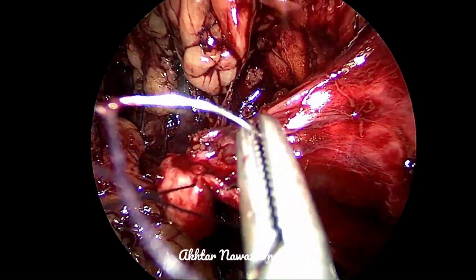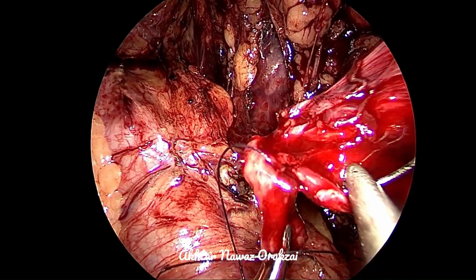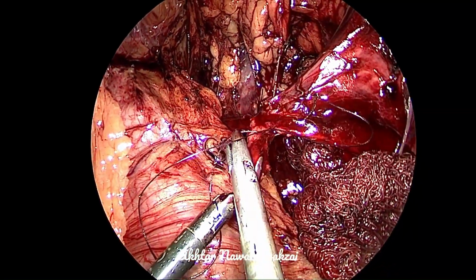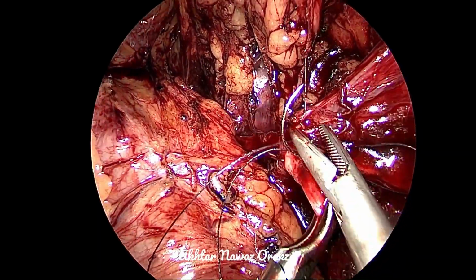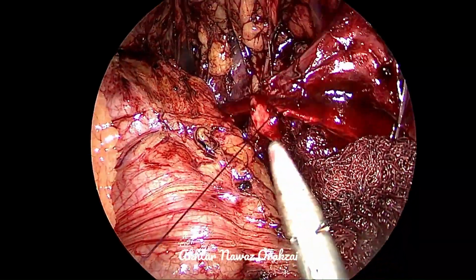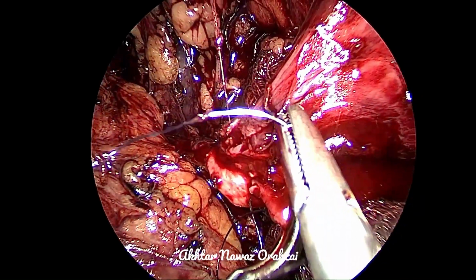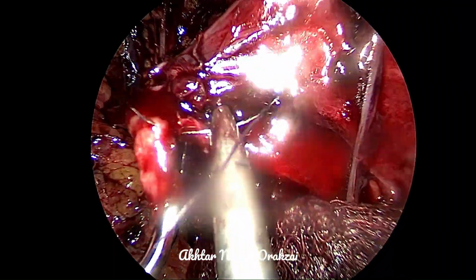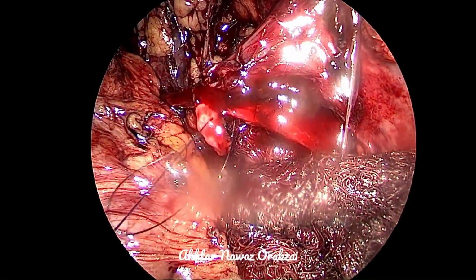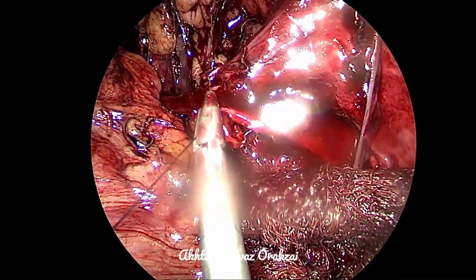So we are always trying to follow this form of pyeloplasty. The principles of pyeloplasty are the same whether you perform it in an open approach, or the laparoscopic approach, or the robotic approach. First of all, resect the diseased segment. Second of all, try to maintain the vascularity of both the pelvis as well as the ureter, especially the ureter, because that will be mobilized.